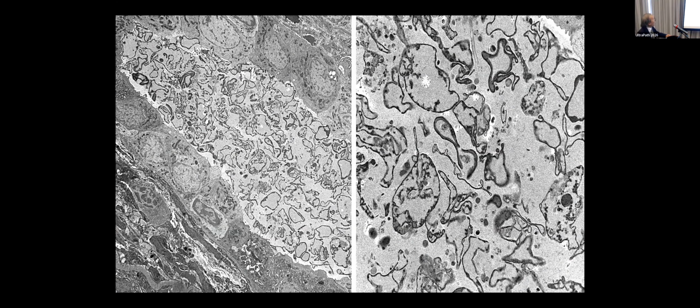That is the electron microscopy of the cast, as you can see here. There is a tubule that would probably represent a distal tubule, and these are degenerated red blood cells. Now we don't see the hemoglobin content anymore, and only the cell membranes of the red blood cells are retained, and here are the typical features of that. Again, interestingly, there is a background of uromodulin.